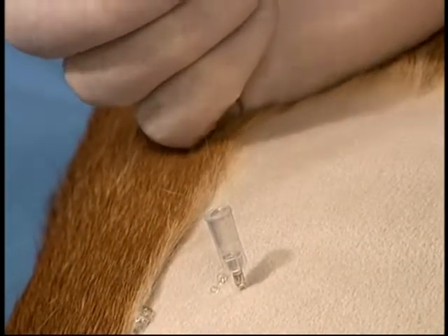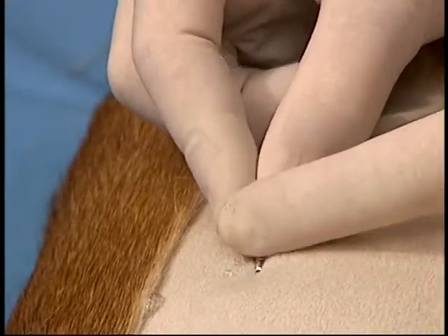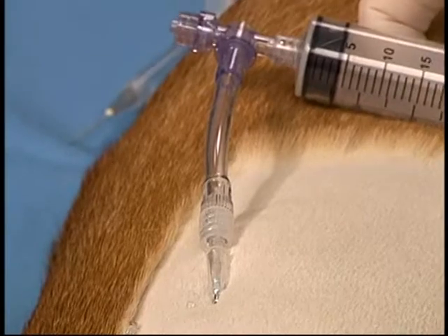Once in, the needle is advanced two to three more millimeters, and then turned laterally, hooking up underneath the ribs parallel to the chest wall, and the Centesis valve chest drain adapter is attached and aspirated.